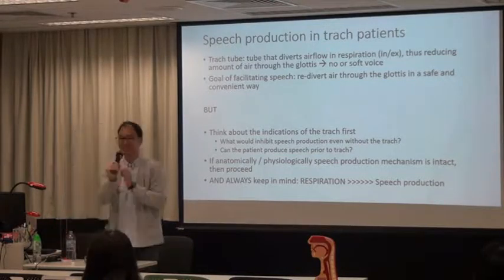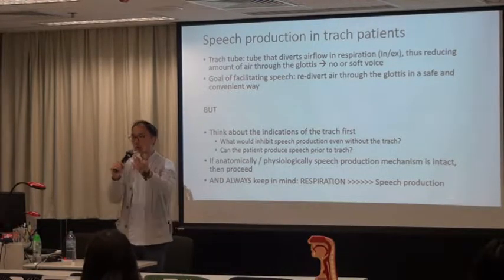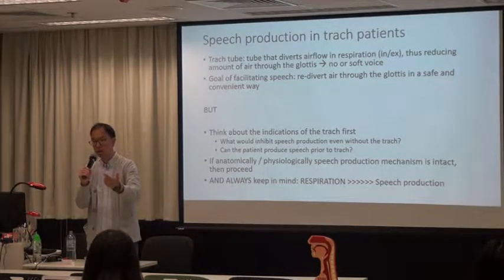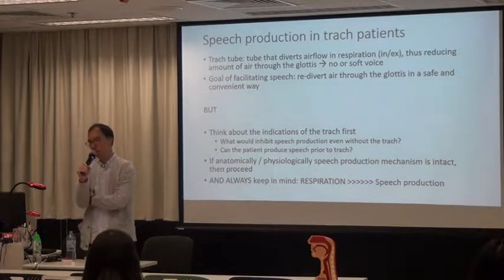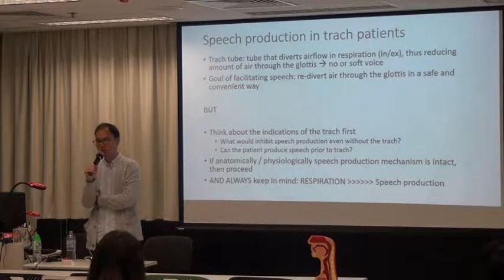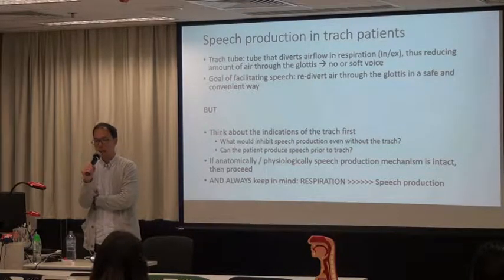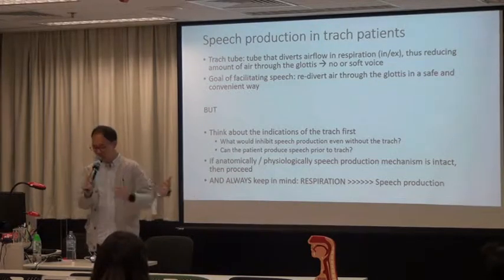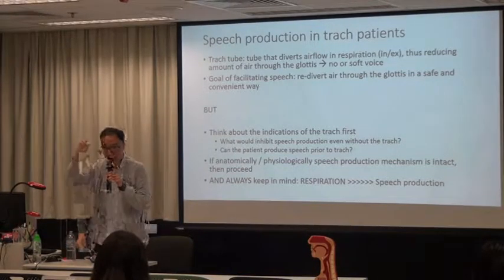What bar? Okay, so the patient has to press on the bar, and then the patient will be able to talk, right? How about if he or she doesn't press on it? Can the patient talk? Okay. Still yes. So it's not actually pushing on the bar, right?